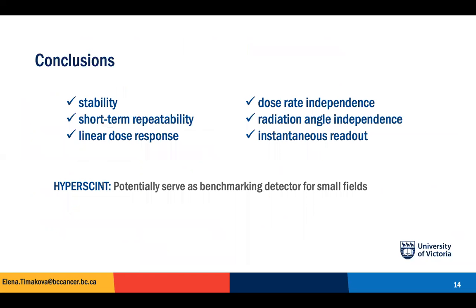Overall, this characterization shows that Hyperscint RP200 with the 0.8 millimeter cubed plastic scintillator detector has desirable properties as a small field dosimeter and could potentially serve as a benchmark detector for small field measurements.